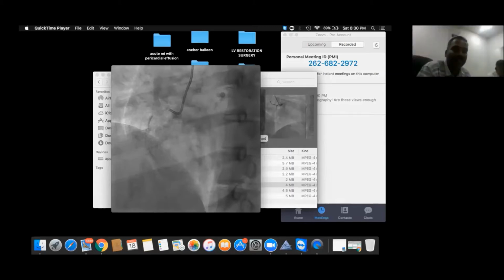I keep telling my patients, with this angiogram, it is difficult for me to plan a procedure. I'll plan the procedure while doing the angiogram, in the same sitting. And sometimes I end up in a second sitting, because to make up my mind for a CTO is very difficult. So CTO is not an ad hoc angioplasty. So probably we would end our discussion. This is what the art of angiography means. That is why we have chosen that topic heading. I hope we justified this topic today.